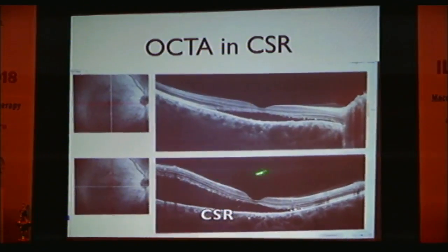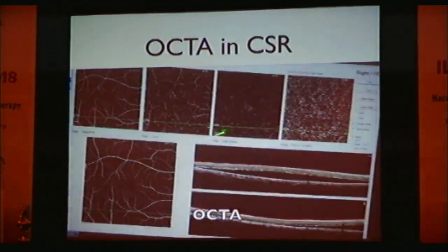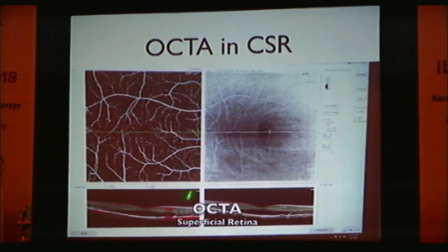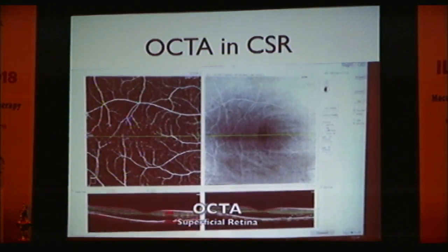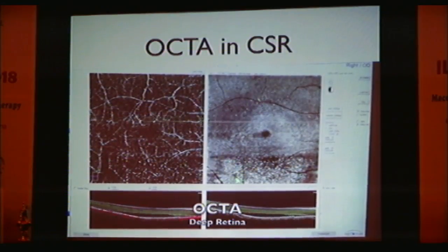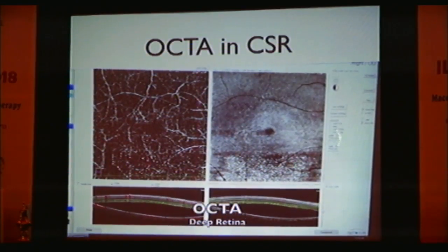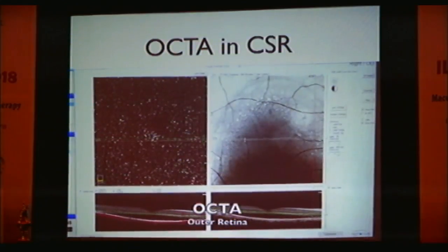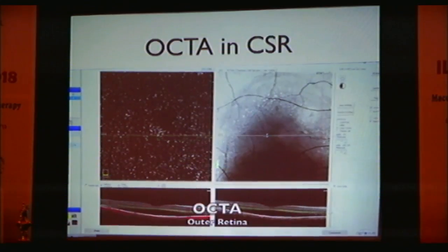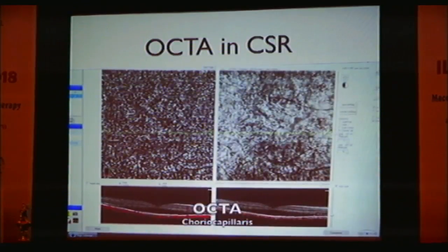This is a patient of chronic CSR, line scan. You can see the thin retina. Actually in CSR, line scan perhaps is, as far as I feel, more important as compared to looking at all these layers, except yes, while you move this line, you can know the exact extent of your CSR, and you can mark that area and accordingly treat the patient with PDT. You can also know the extent by various other modalities, by autofluorescence and all.